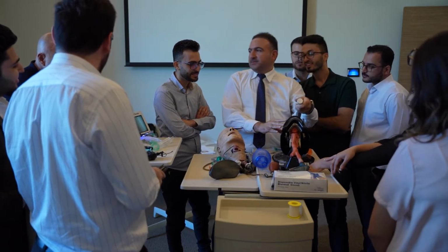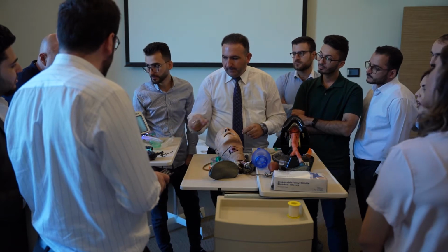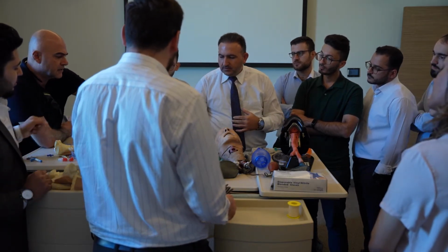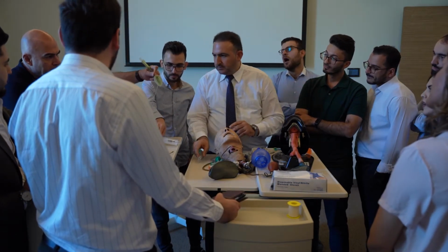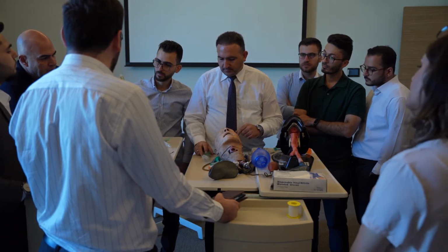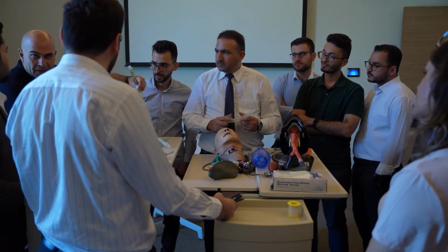You know why all guidelines go with the basic, non-invasive, less traumatic, less harmful approach. Even the 2021 guideline is satisfied by putting these airway devices. This is called iGel, an extraglottic device, like a laryngeal mask. You simply hold it like a pen and it settles on the pharynx. This should face the pharynx and temporarily occlude the esophagus, but this is not 100%. Sometimes it can even enhance vomiting and aspiration, because the patient cannot expel it out.